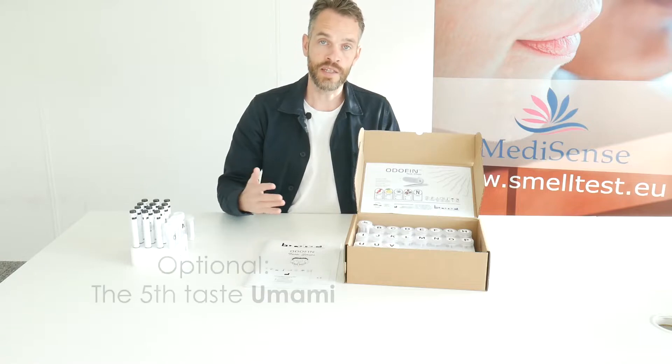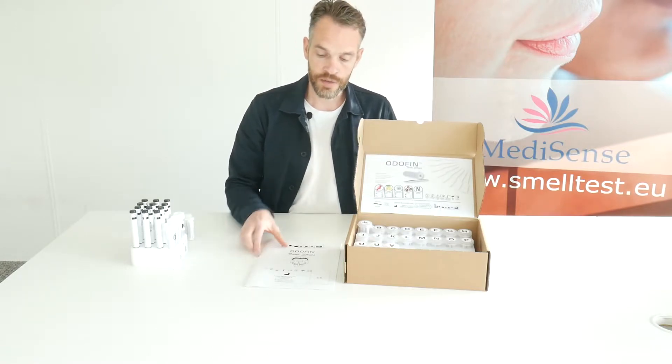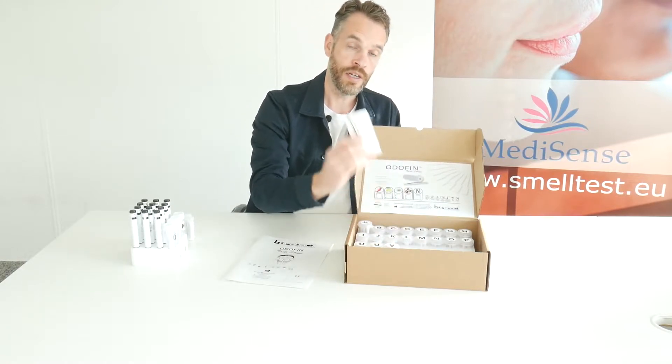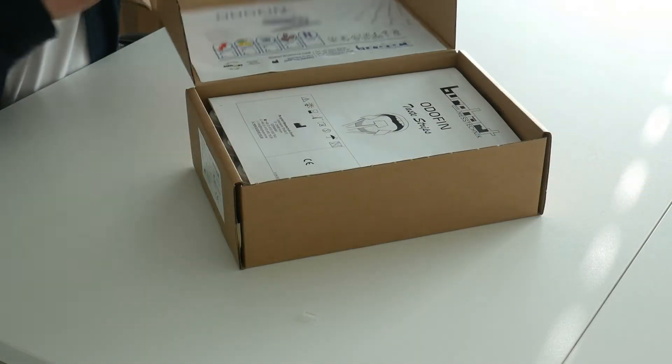Optionally you can also add the fifth taste, umami. The box will be delivered complete with the manual. For example, you have a little tweezer to take the strips out of the boxes.